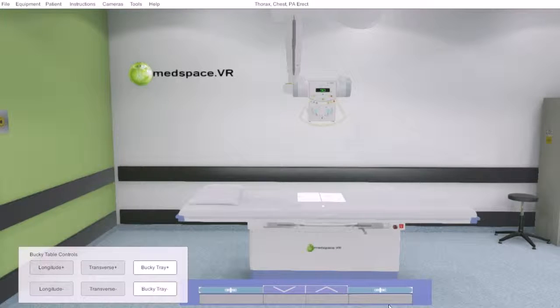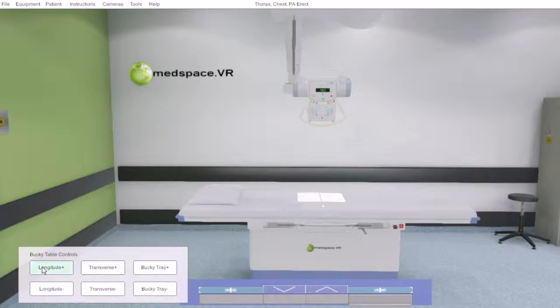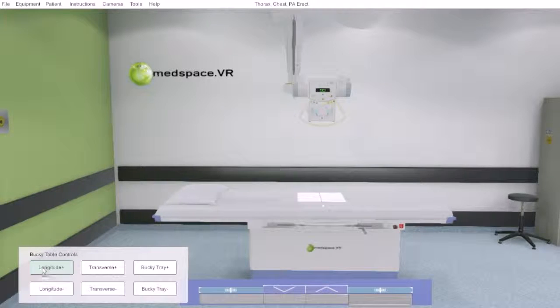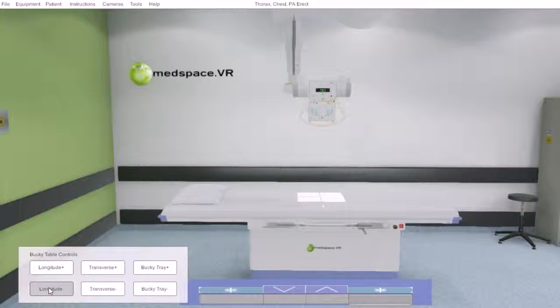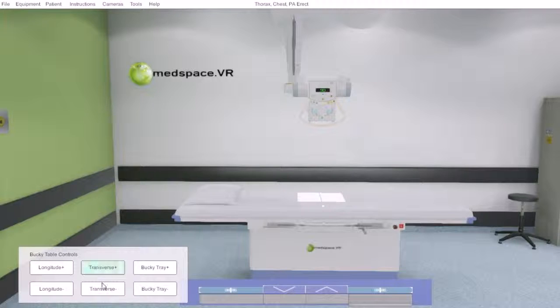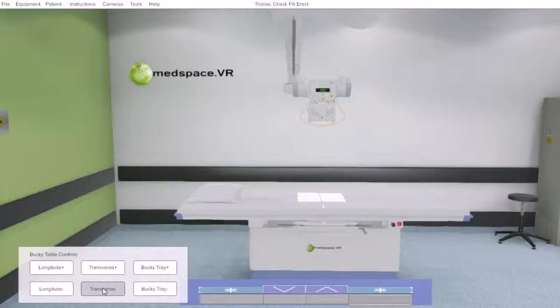By engaging with the foot switch release, we then have access to movement of the table longitudinally and then transverse movement.